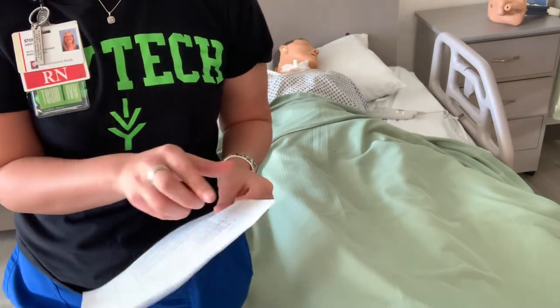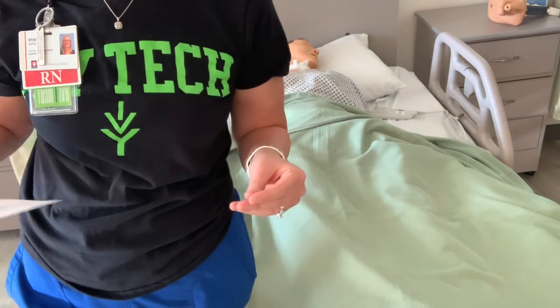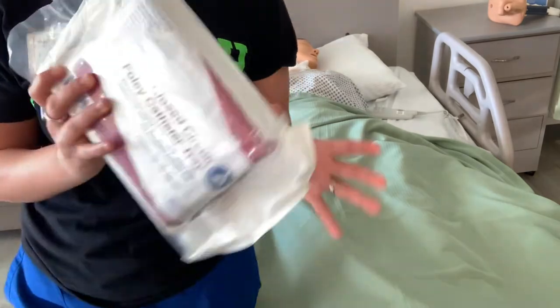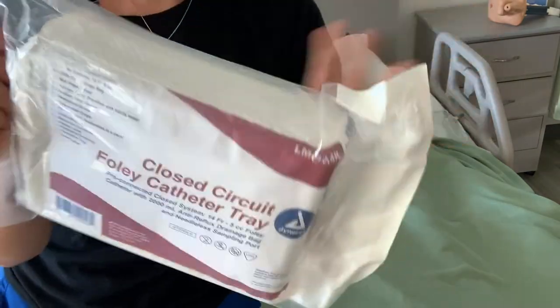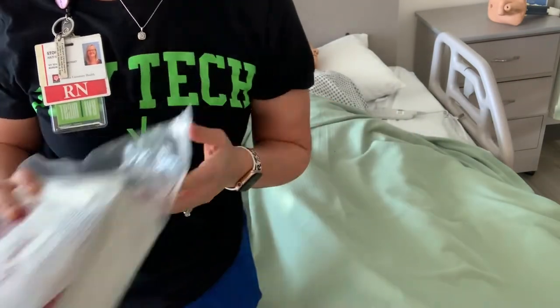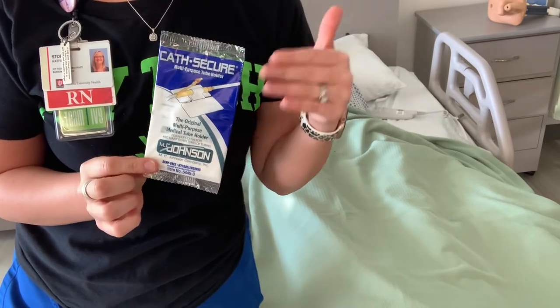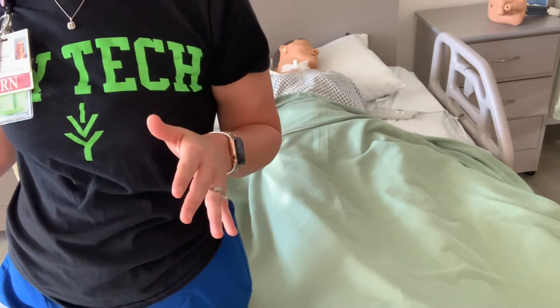Make sure you look up at the top here for your supplies needed. For this one, you're going to need your Foley catheter kit and your cath secure device. In your kits, it should look something like this — sometimes they look a little bit different, but it should say something to the effect of Foley catheter tray or kit. Your cath secure device is usually in your bag in one of those plastic bags that you have. Those are the two supplies you guys are going to need.